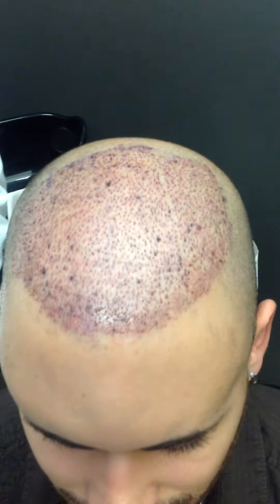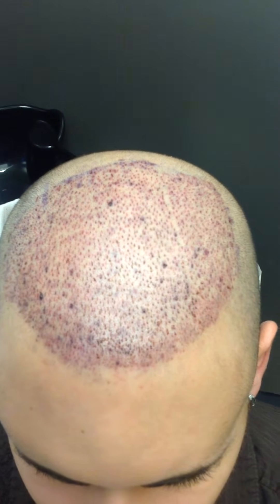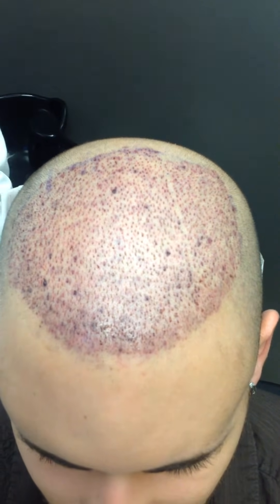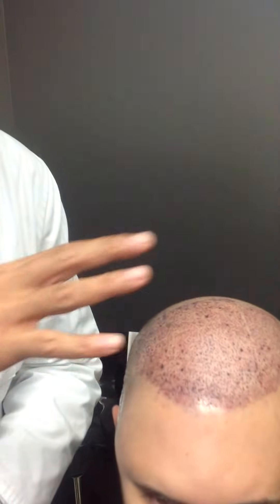So come in with the camera if you can. You can see in this area, we did a calculated density that we want to plant at roughly 30 to 35 grafts per square centimeter. This is what it came out to be without interrupting or hitting any of his hair that's there previously. That should help with shock loss and with preserving his pre-existing hair in general to give us better results.